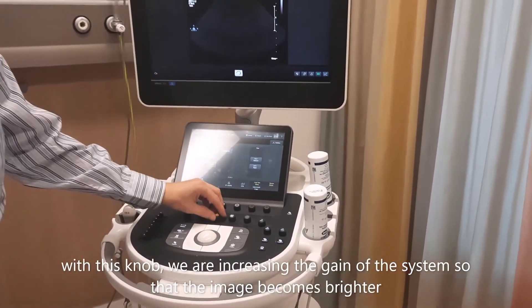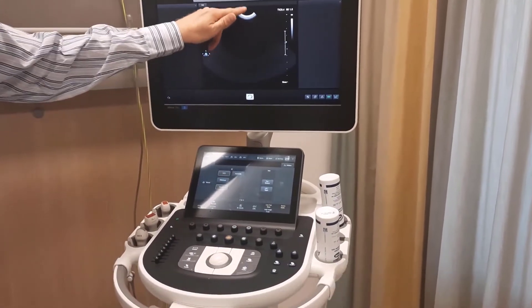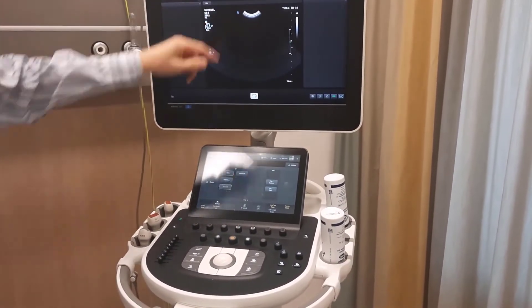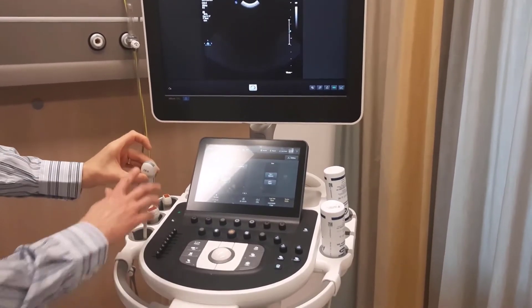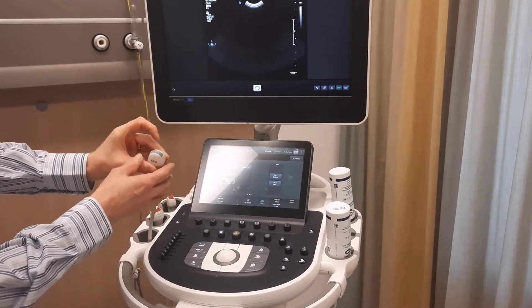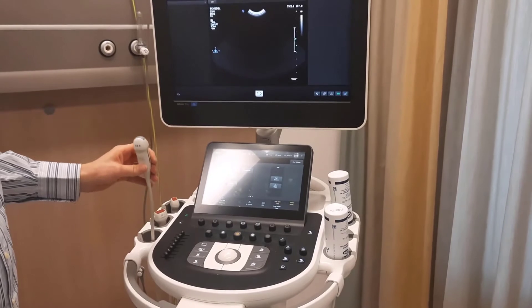For this type of transducer, we make a picture at 90% gain so you can count the rings. When the transducer gets old, the face can harden and then you have poor image quality.